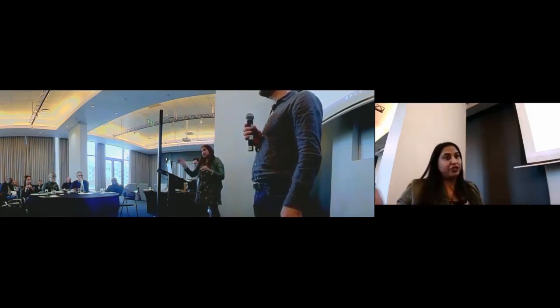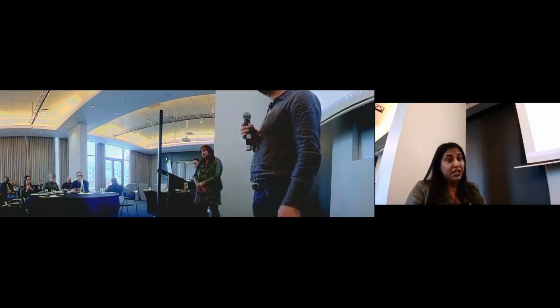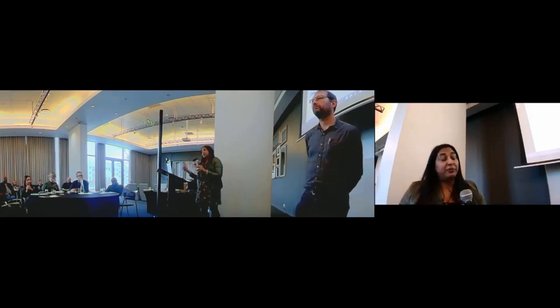And the wide local excisions that Francois sends, he's quite thorough because he often sends shave margins as well. So if he's not convinced that in theatre he's got everything, he'll often send shave margins just lateral to the closest point that he thinks tumor is going to be involved in. So that actually helps quite a lot. So we put that into the report. So what will happen is in a wide local excision, if you have tumor at that cautery margin, the medial shave is actually taken as the true margin.